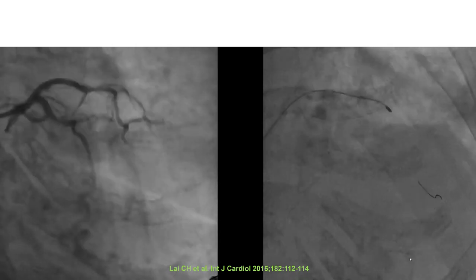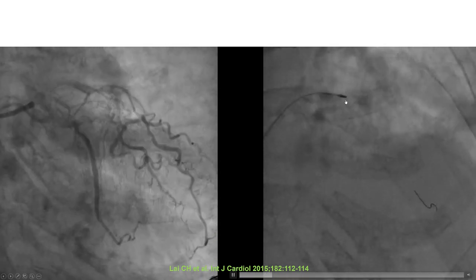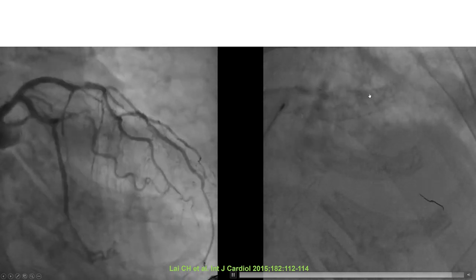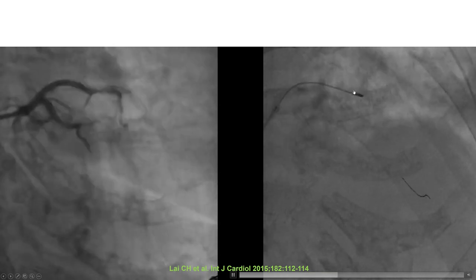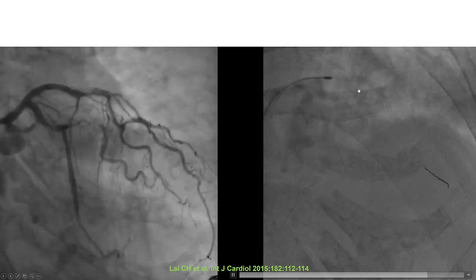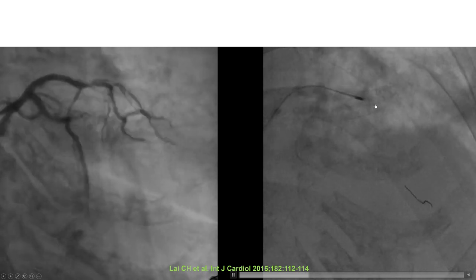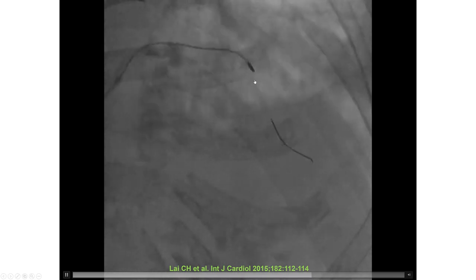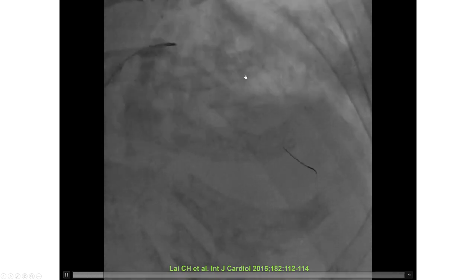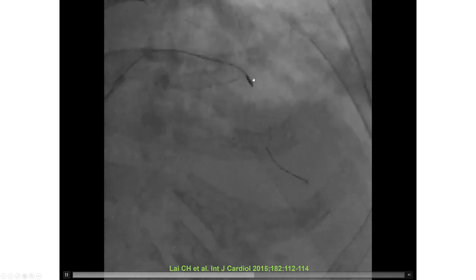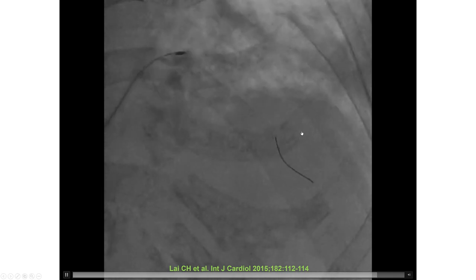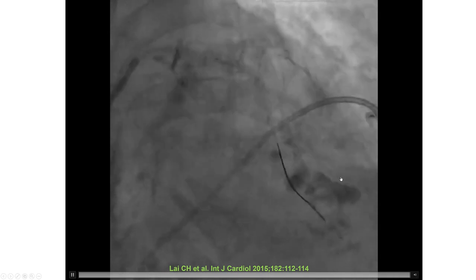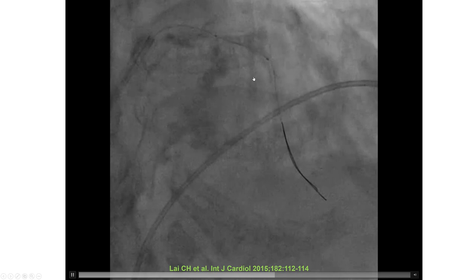This is a published case of rotational atherectomy that resulted in perforation. In the initial part, this shows how rotational atherectomy should not be done — with prolonged contact of the burr with the lesion. Ideally, one wants a pecking motion — a back-and-forth motion — with light and limited-duration contact of the burr with the lesion. Further along, there is resistance to advancing the burr and very prolonged attempts at rotablation. Eventually, this led to a dramatic perforation — the burr essentially cuts the wire and exits the vessel. As expected, this led to a massive coronary perforation; the patient is asystolic given the exit of the rotablator burr from the coronary vessel.